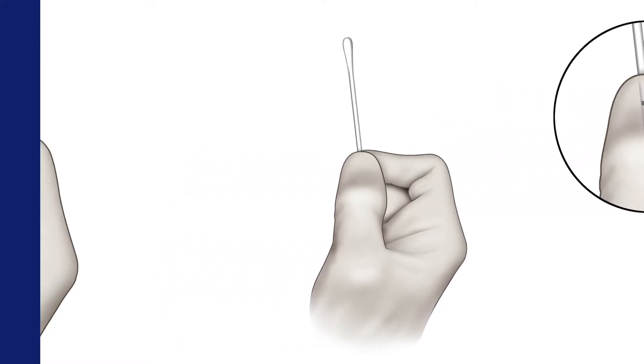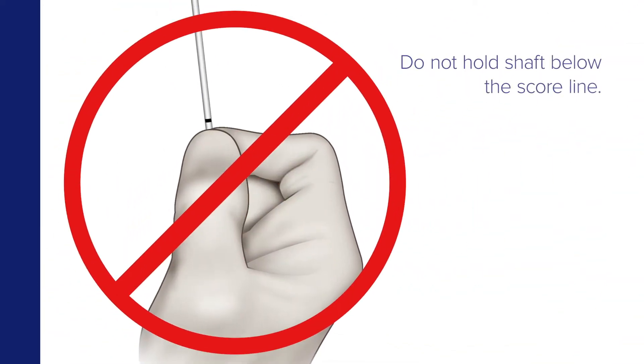Now hold the swab, placing your thumb and forefinger on the middle of the shaft so they cover the score line if it's present. Do not hold the shaft below the score line.